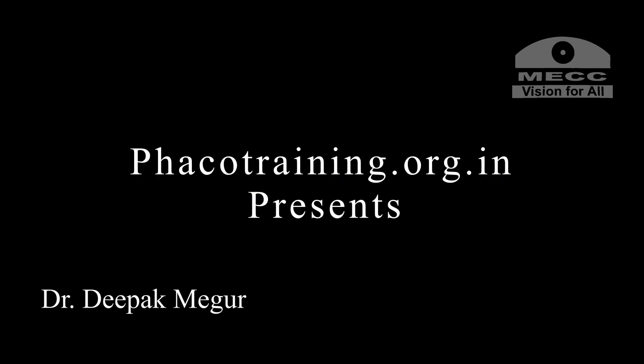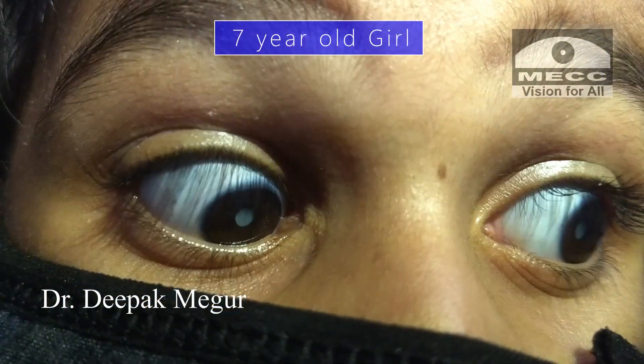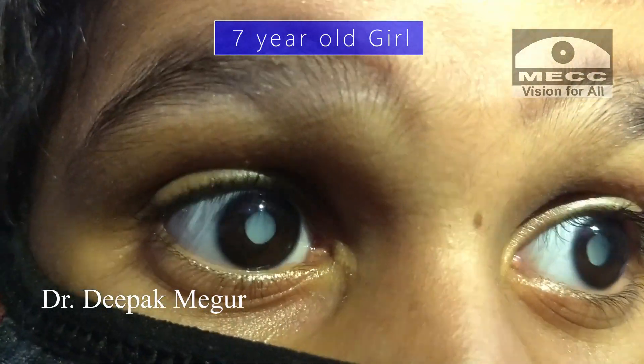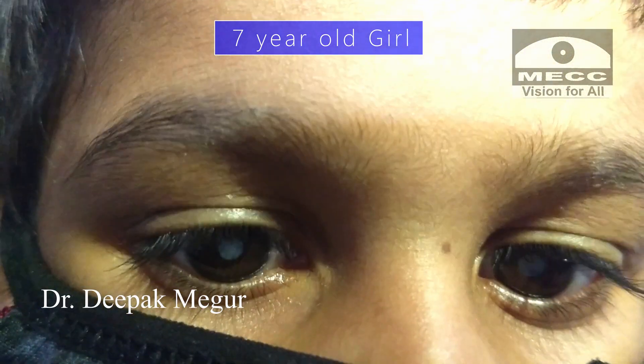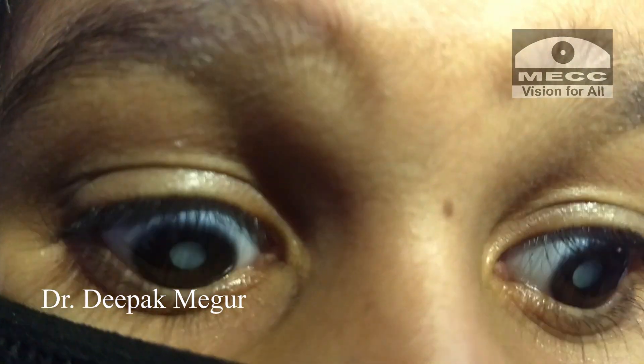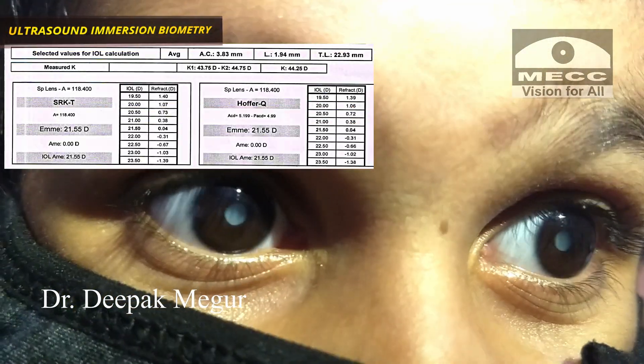Hello friends. Today's case is about managing congenital cataracts. This is an unfortunate seven-year-old girl with congenital cataract which has probably been neglected for years. She has nystagmus and poor fixation. She requires surgery and ultrasound immersion biometry was done. We are aiming at about plus one diopter. So let's begin the case.